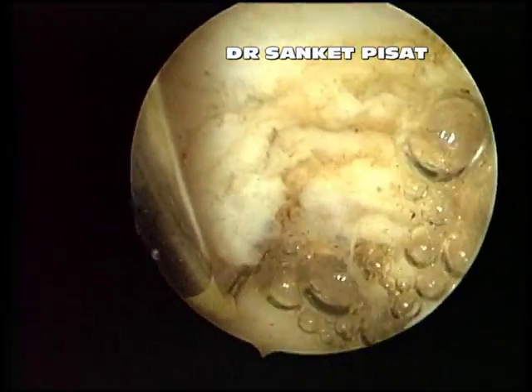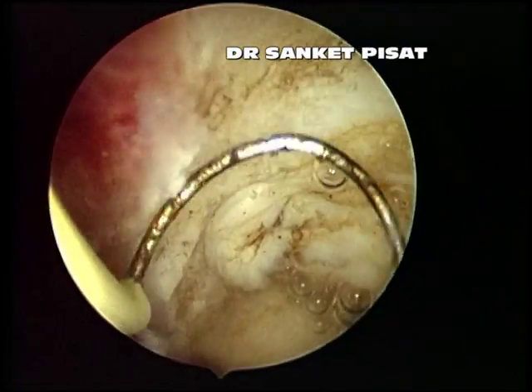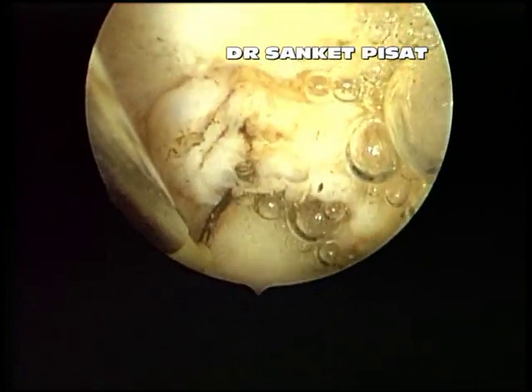After a majority of the chunk of the fibroid has been removed, the process is slowly continued, removing the remaining bits of the fibroid gradually away from its attachment to the normal myometrium.